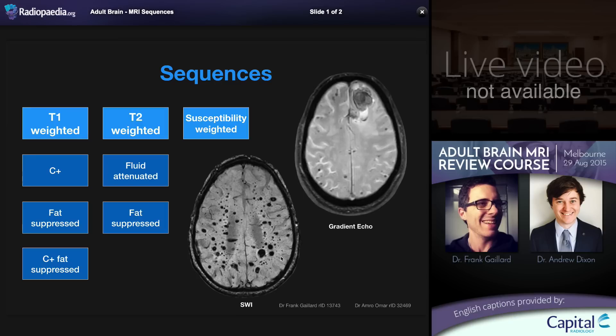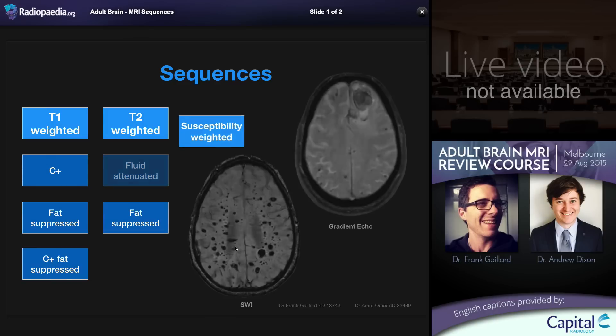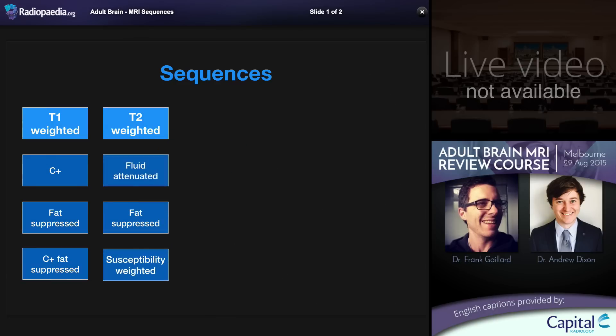Susceptibility weighted imaging at higher field strengths is particularly sensitive. An earlier and still widely used susceptibility-sensitive sequence is gradient echo imaging, but there are a number of others. These sequences probably deserve their own column but we'll place them under the T2 weighted column, as many of them are T2-star weighted.